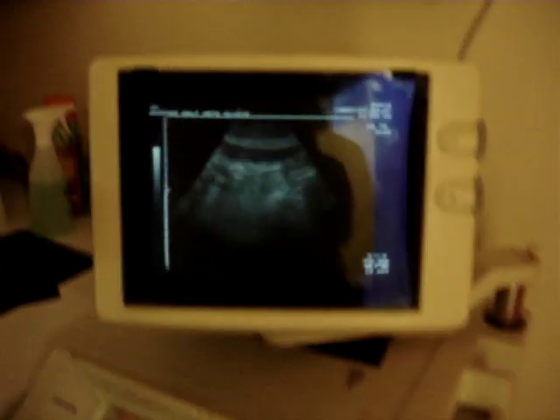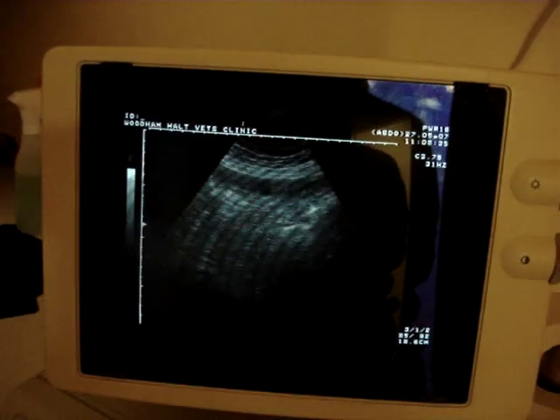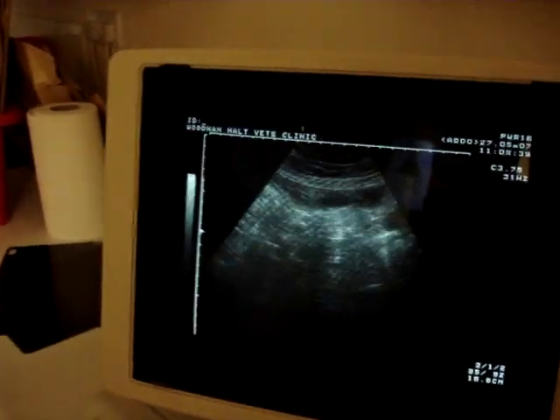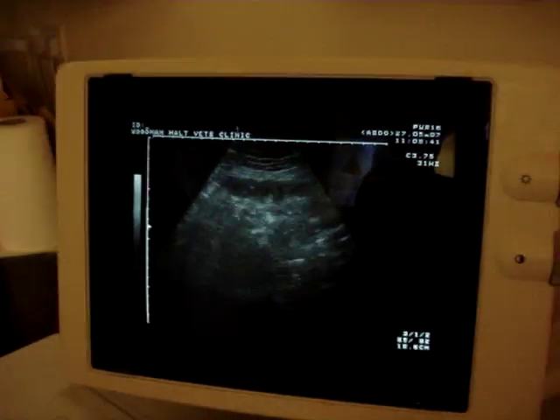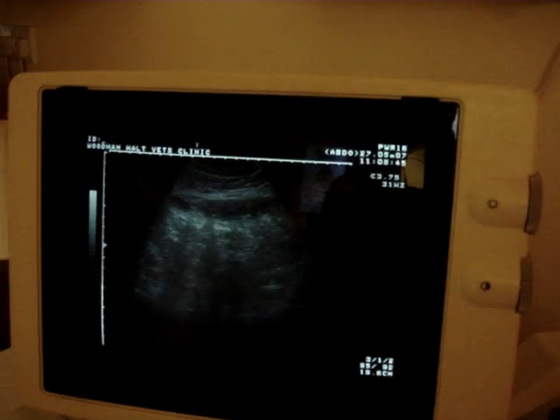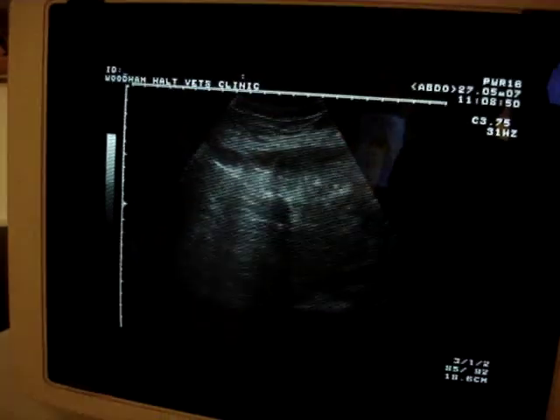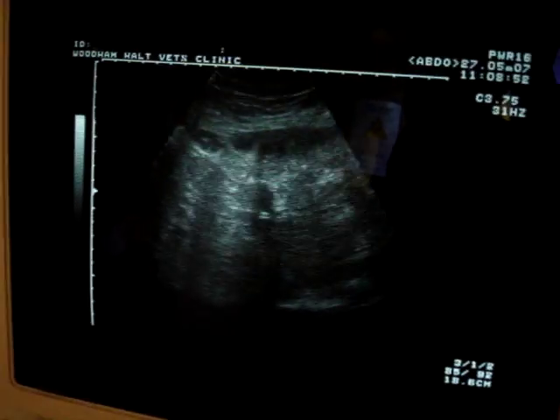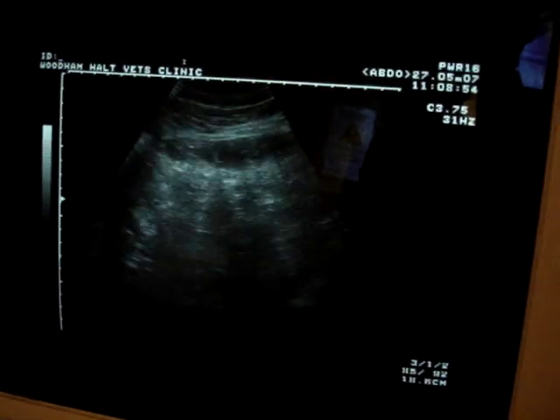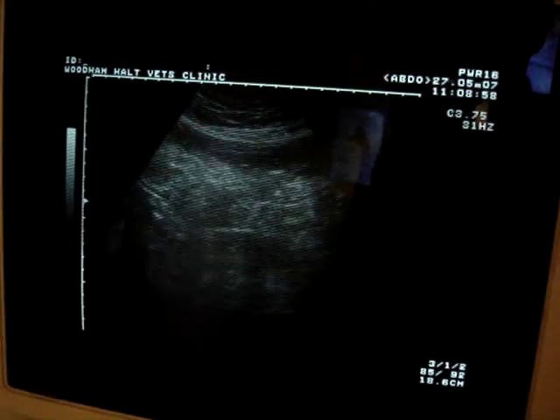What have we got here? This is my liver. That looks sick — this is my liver, yeah. Now I'm going to scan through it. You can see some of the vessels at the top there, nice round vessels running through. You can see the blood passing through as you look now. And that's fine — I like my liver. Still functioning.